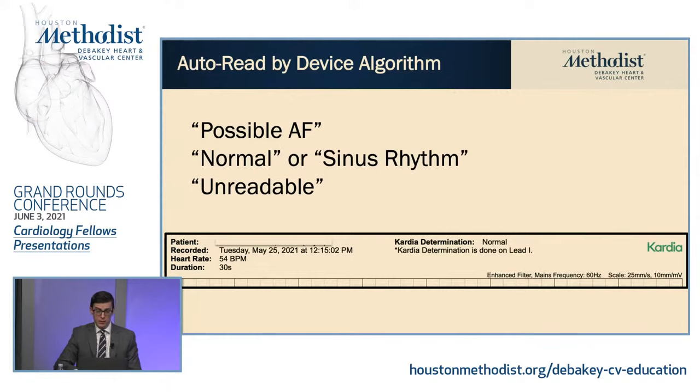The automated read by the device has several possibilities: it can tell you it's possible AFib, it's normal sinus rhythm, or it's unreadable. The algorithm is specifically looking for AFib — not other arrhythmias, not ischemia. This is an example of what it would look like at the top of the PDF. It gave me my heart rate, the duration, and it gave me a normal read even though the heart rate was 54 — which I would code as sinus brady — it called this normal because it's not AFib, it's not unreadable, and it's in sinus rhythm.